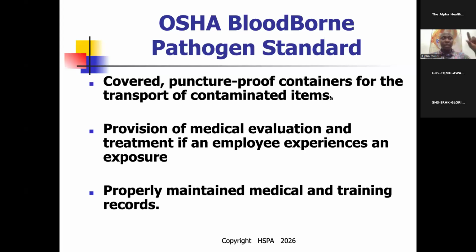So that when there is an infection, we can say that this serial number of equipment was used on this patient. And then when was it used? What was the process? What does it look like? We can do that bilateral tracking from the endpoint to the sterile processing point. And there should be documentation. The same way, we have to document our sterilization processes.